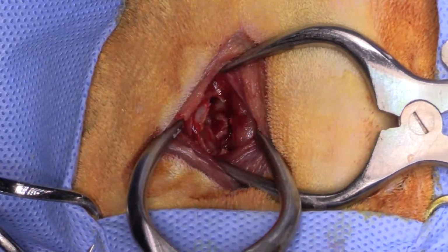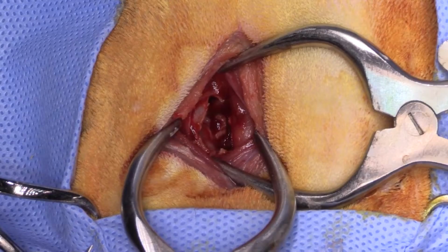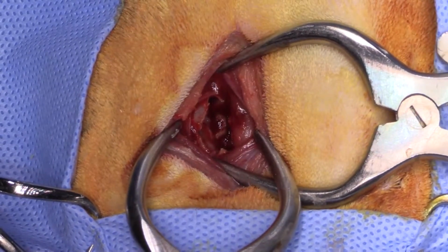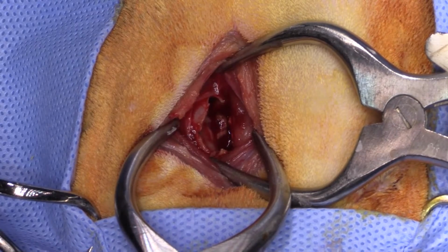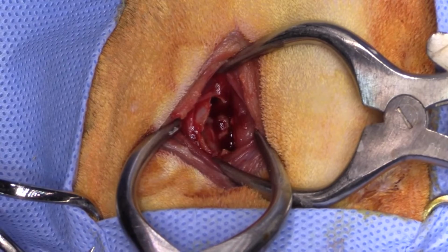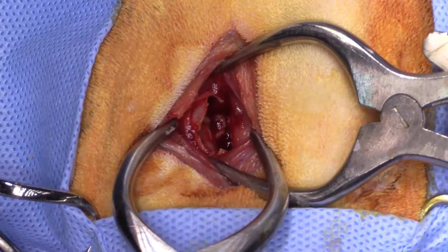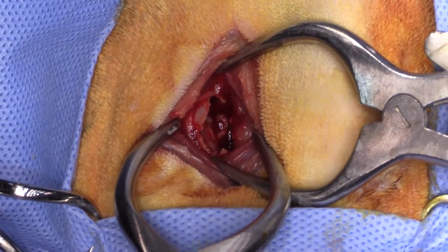Okay, can we get a biopsy pot? Just grab that pack of suture there, and I'll just drop the polyp onto that. And we'll hand that off to Janine. So we'll just hand that off to you.